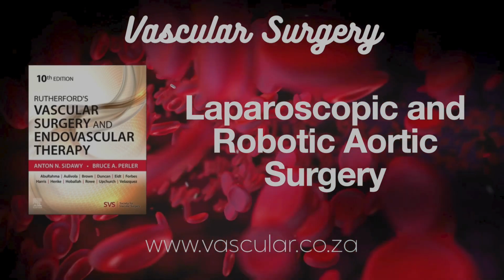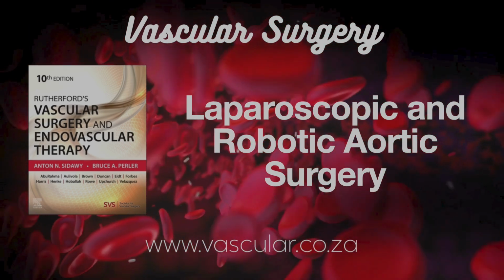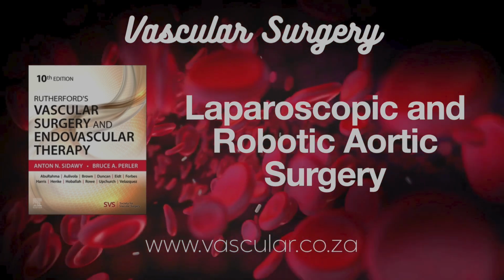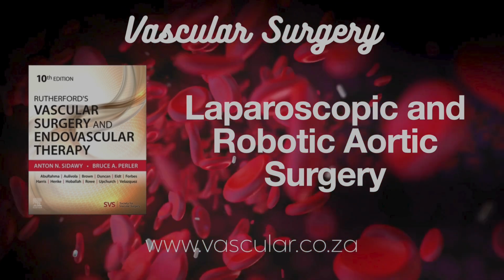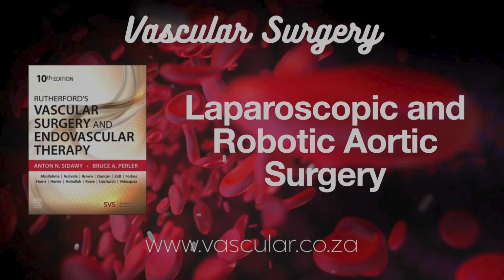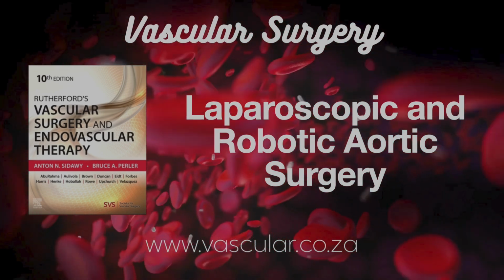Today, we're tackling a really interesting area, laparoscopic and robotic techniques in aortic surgery. That's right. We're going deep into these minimally invasive alternatives to the big open operations. Exactly, for things like abdominal aortic aneurysms, AAAs, and aortoiliac occlusive disease, AIOD. And it's important to say, while those catheter-based endovascular procedures are super common now, these laparoscopic methods still have a crucial role for certain patients where maybe endovascular isn't the best fit.